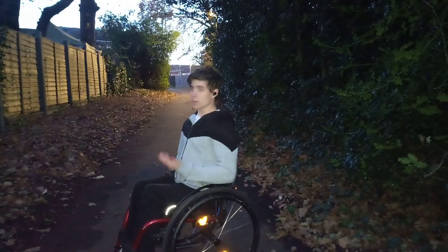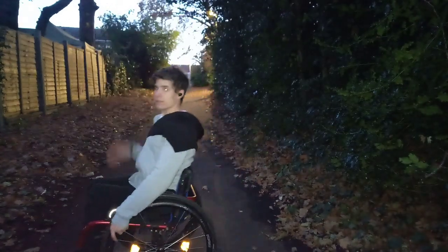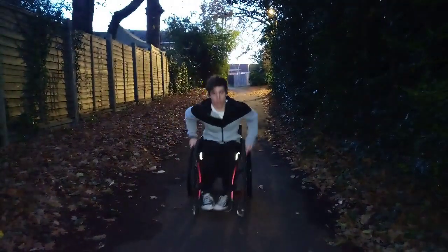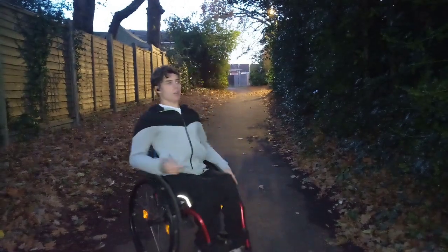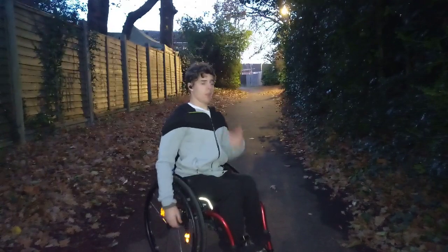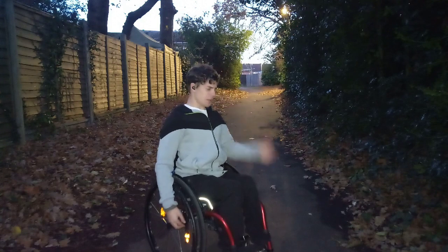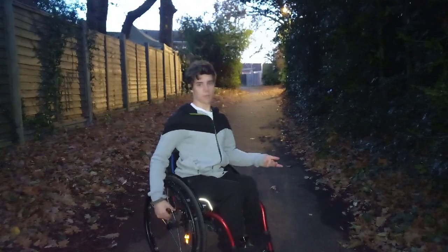Since you're just going to be slowing down, assuming the grip isn't that good, it helps to just pull back, because normally if you're pushing along and you pull back, you're just going to stump forwards and it's not going to be very good. But because it's slippy, you're not going to do that. You're just going to slow down really quickly. A good thing. Obviously, it depends on the ground surface. I'm talking about if it's completely iced over, so just keep that in mind.